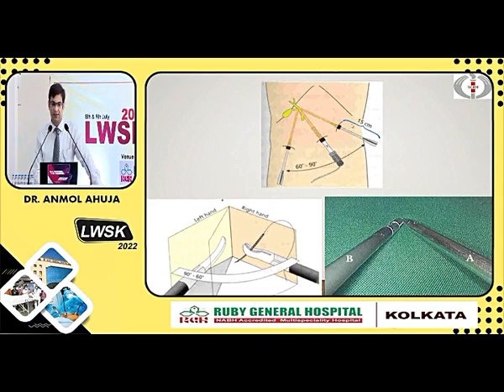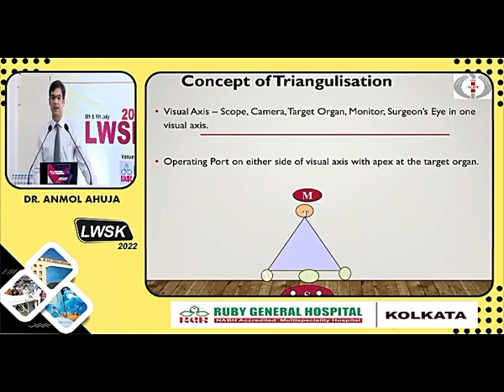So this is the manipulation angle, this is the azimuth angle, and the elevation is here between the horizontal plane and your elevated instrument. Then comes the concept of triangulation and sectorization while placing the ports. As we are made by God, we have eyes in the center of our body and two arms by the side. A similar principle is followed when we are doing a triangulation. So the camera stays in between and both your instrument arms come from the side.